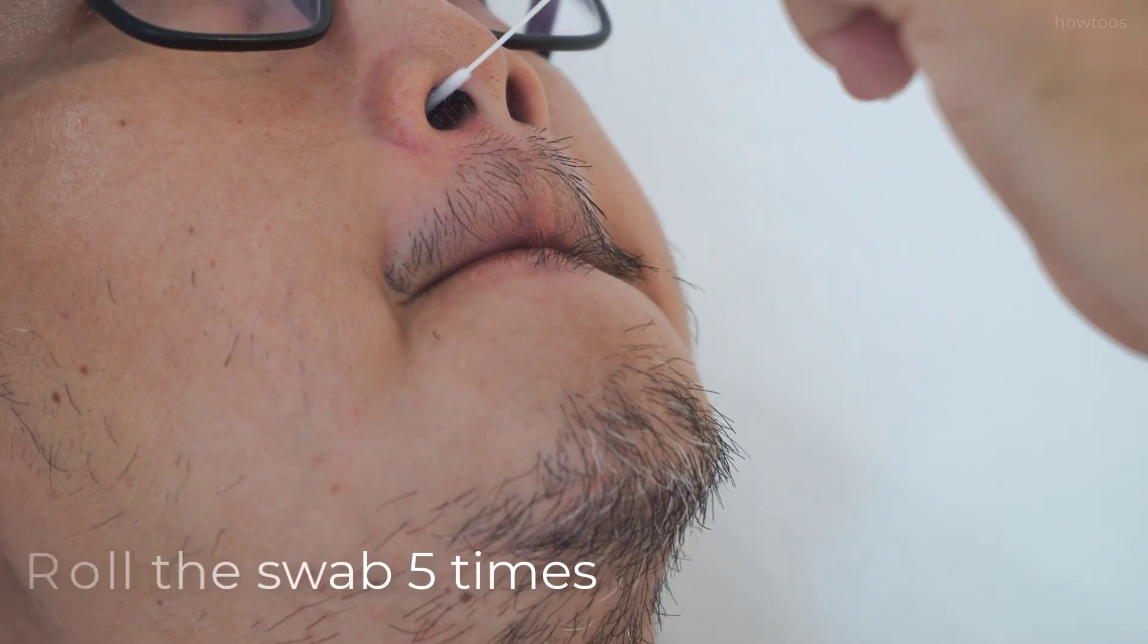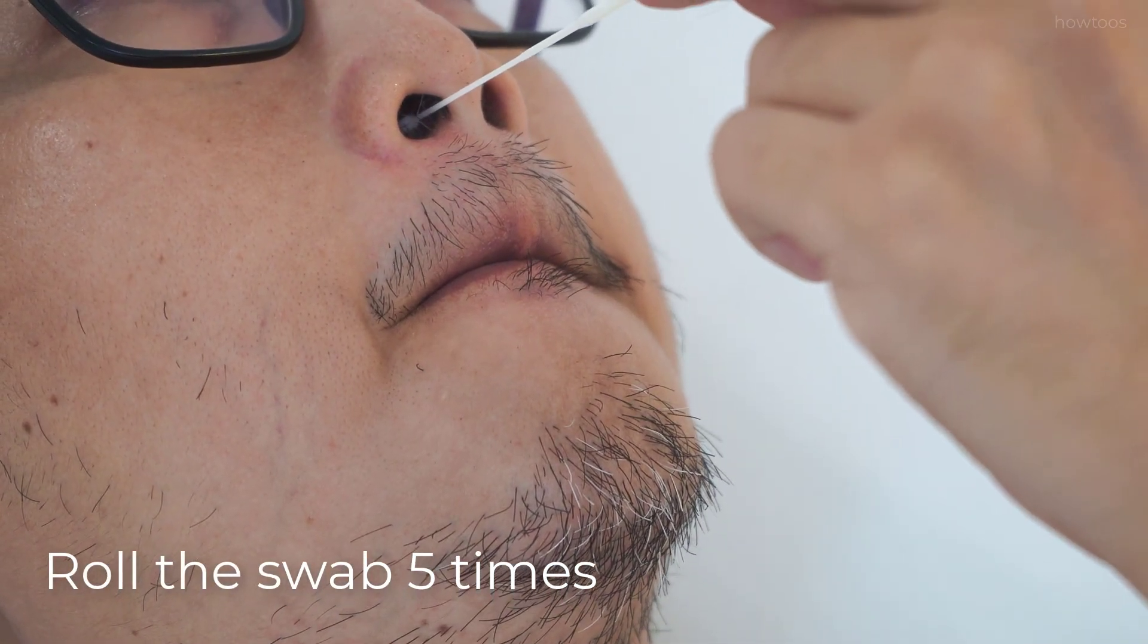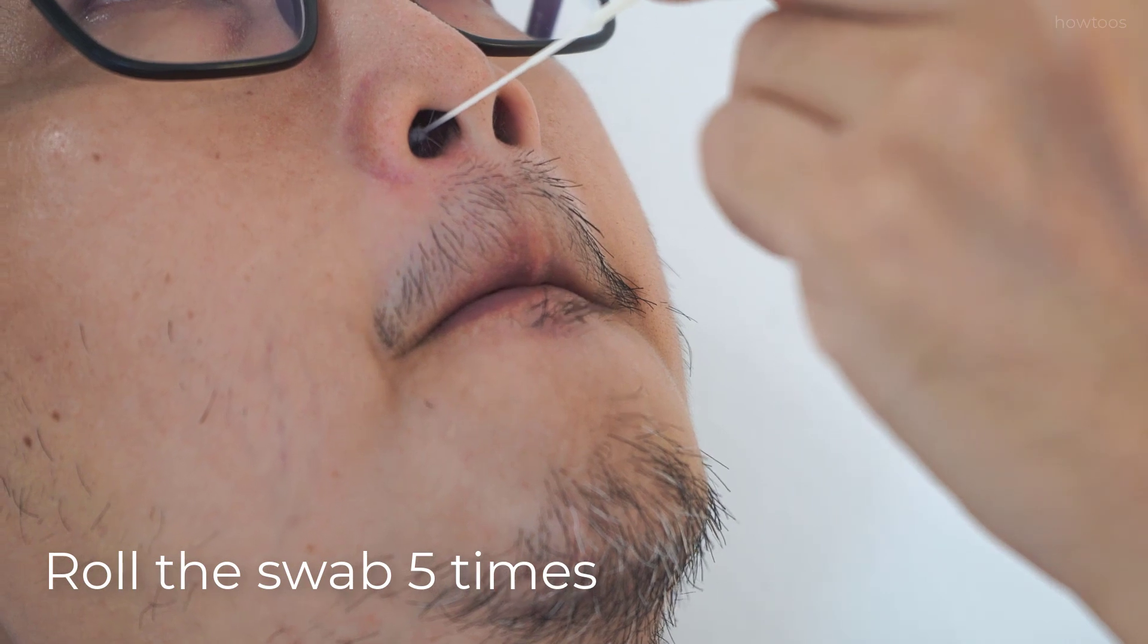Tilt your head back lightly for around 70 degrees. Insert the swab until you've reached the posterior wall of the nasopharynx and gently rub and roll the swab for around five times. Slowly pull out the swab while rotating it.